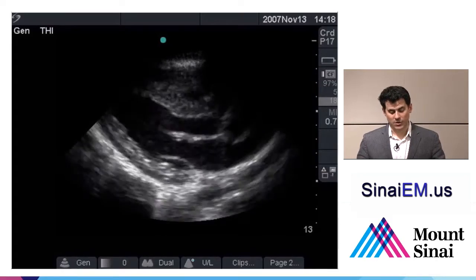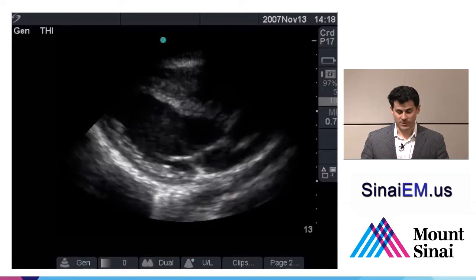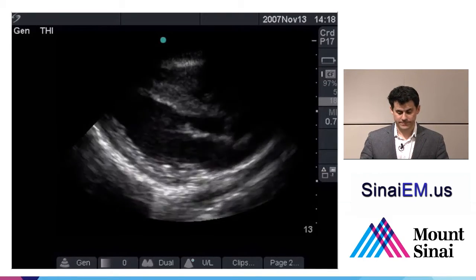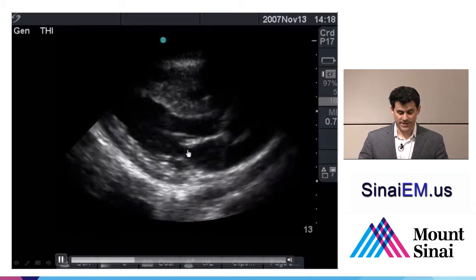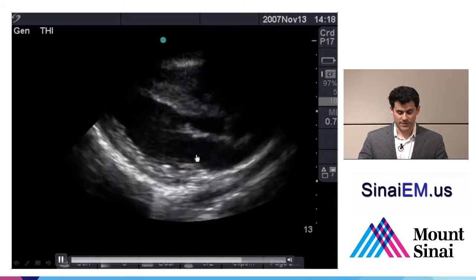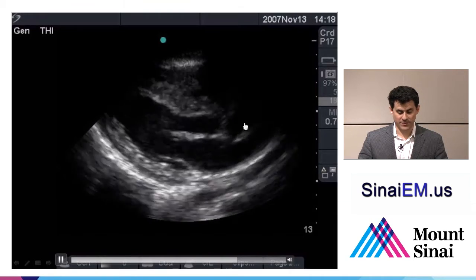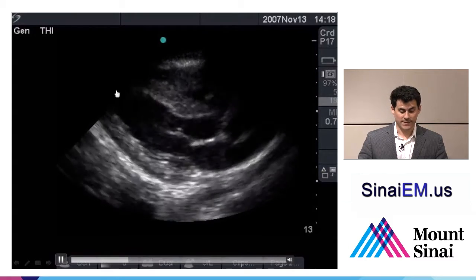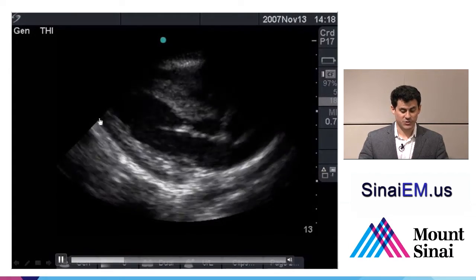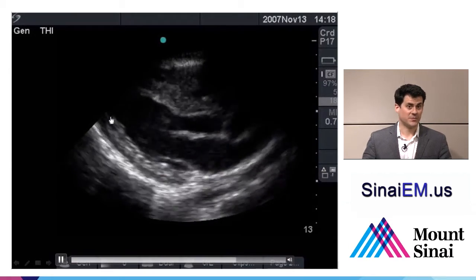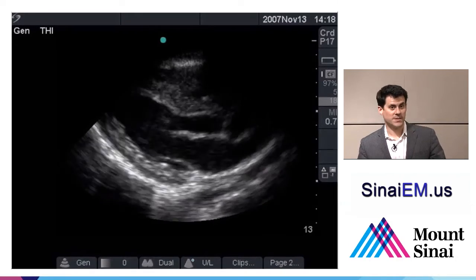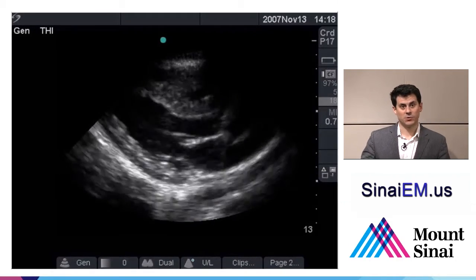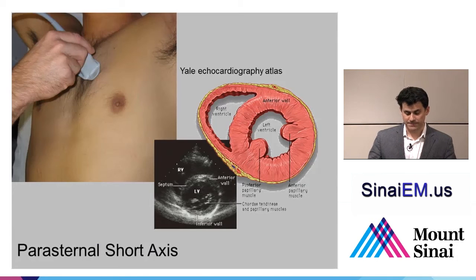This is a good long axis view of the heart. We can see the mitral valve down towards the bottom, the aortic valve up here, and the apex is just off the edge of the screen. It's helpful to fan the probe back and forth — sliding out towards the apex and back towards the valves — to make sure you're in the right plane.